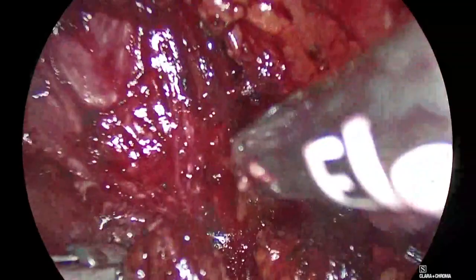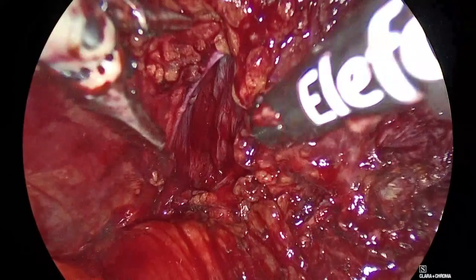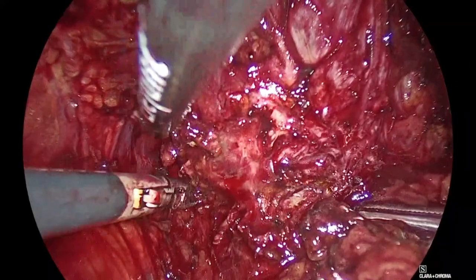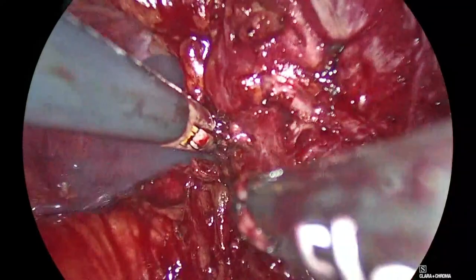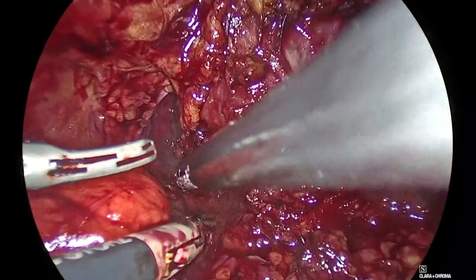Good. Show me. Go back. Aspirate, Panagiotis. Come closer, Padeli. Where is this bleeding from? Why is the bipolar doing this? I mean, it works, but at a certain moment it makes this noise. I don't know why. Okay. Increase the gas by one, please. Gas, 16.